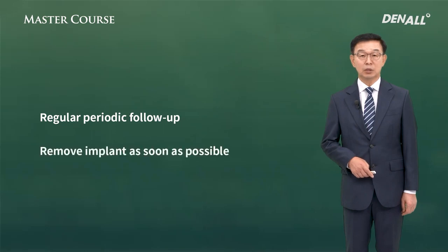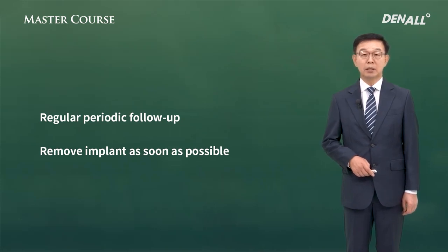If the implant has migrated into the sinus, you need to remove the implant as soon as possible. To be able to do this, you need to know the right techniques to remove the implant ahead. I believe that would help you a lot.